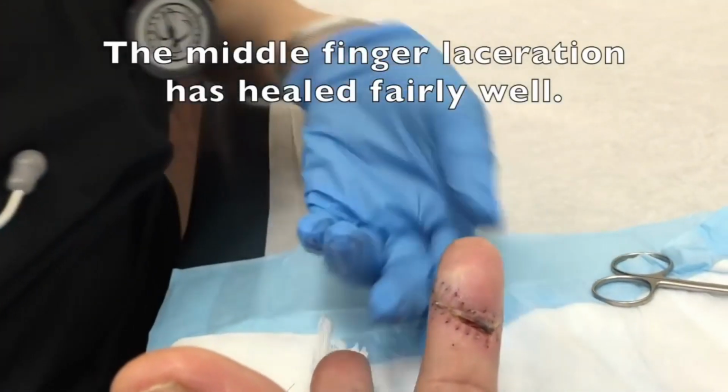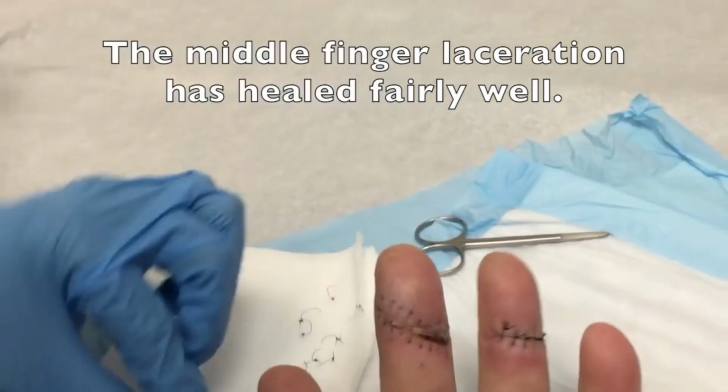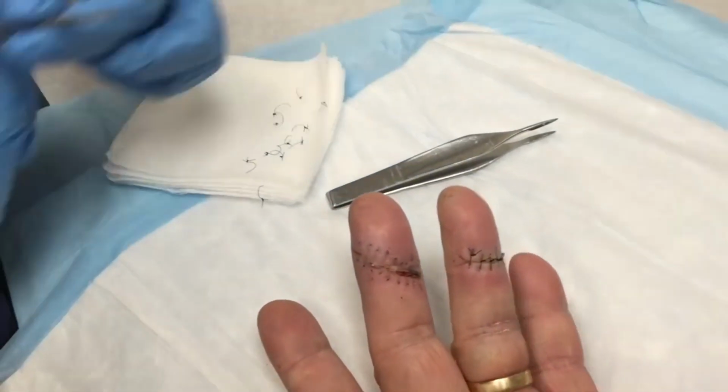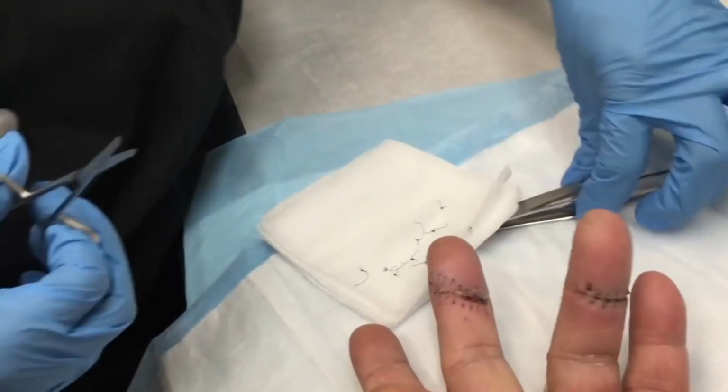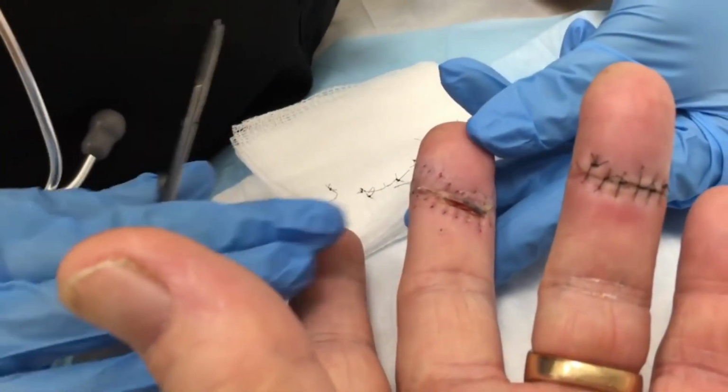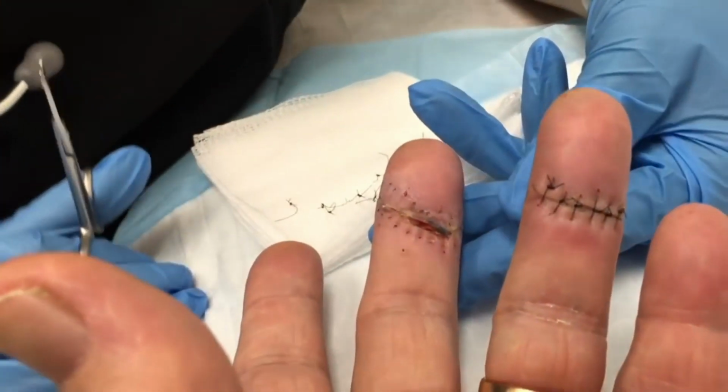Look at that. Okay, that's pretty well healed right there. One finger down, one to go. I think what we'll do is we'll just put a bandage on that when you're done. That looks like it's healed real well. Looks like you had a good doctor, and this has healed very well. Okay, let's get the next one.